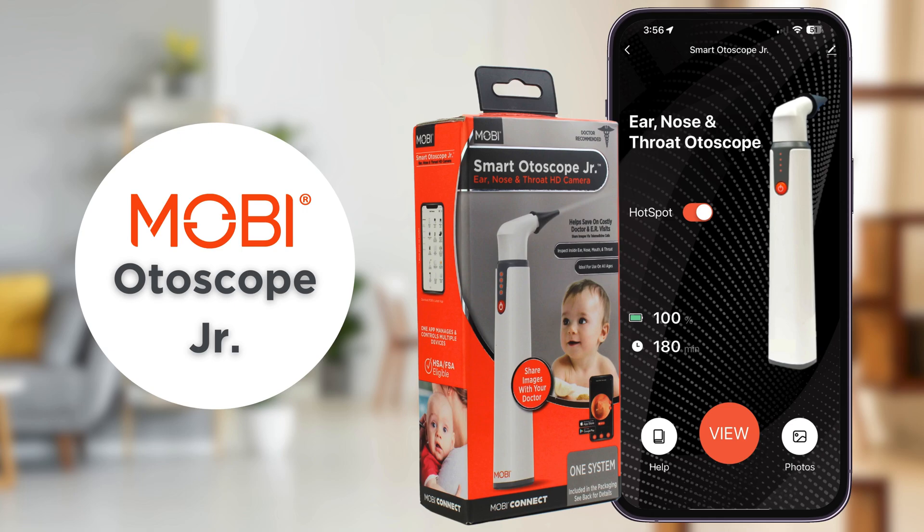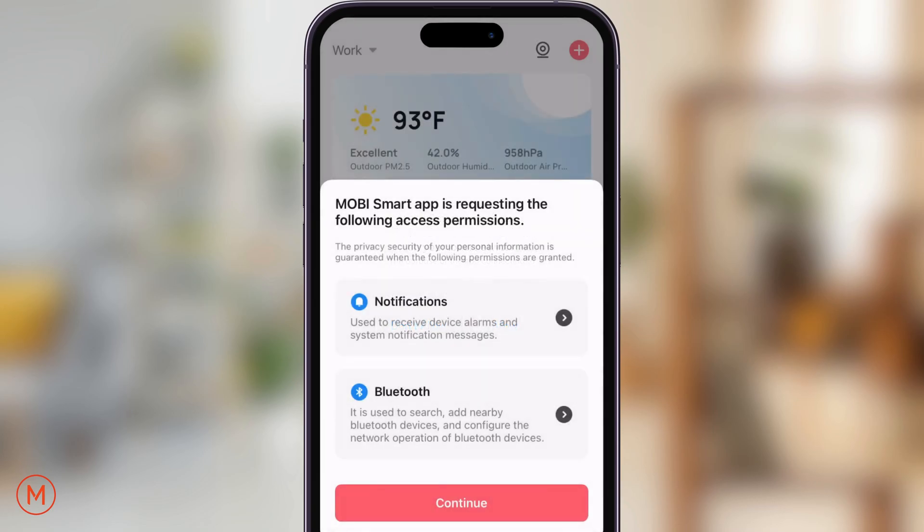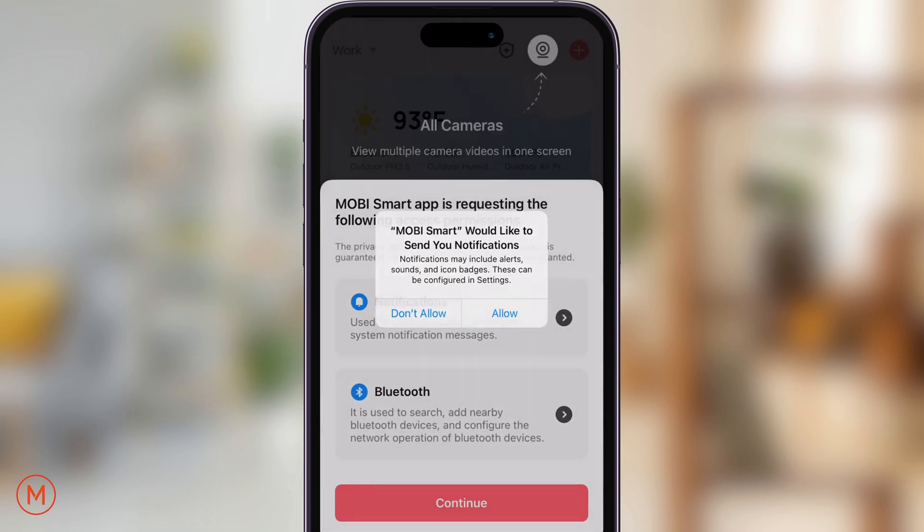Hello, in this video I will demonstrate how to connect the Mobi ENT Autoscope. To begin, please download the Mobi Smart app and sign up for an account. Please accept or allow any pop-up messages that the app asks for, such as Bluetooth, location, and notifications.